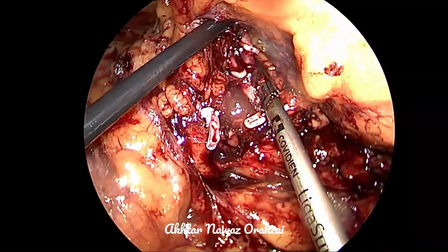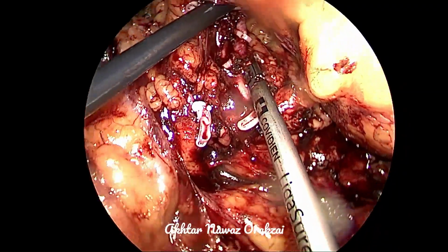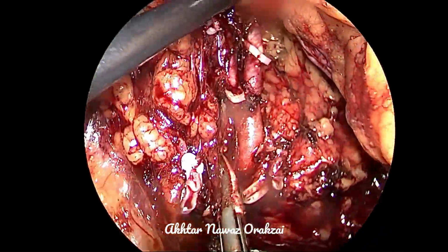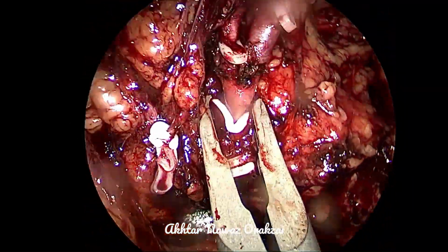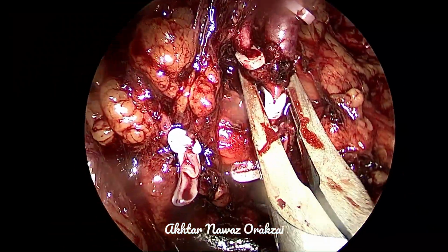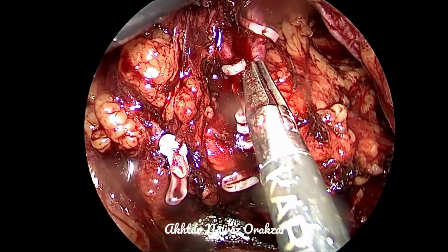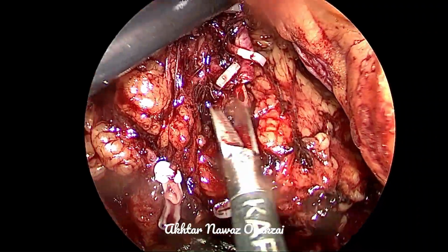It is important to dissect the tissue posterior to the artery. Here again, that principle remains the same, that dissecting the lymphatic tissue away from the artery will give you more length of the artery. It is a length which is sufficient enough. Instead of 2 clips, we applied 3 clips, and still we have space, so we can cut both the branches of the artery separately.